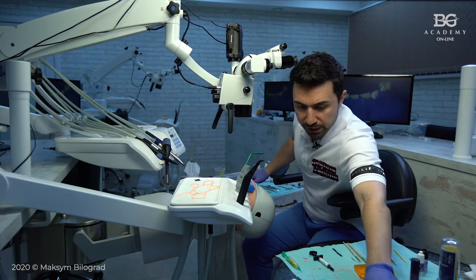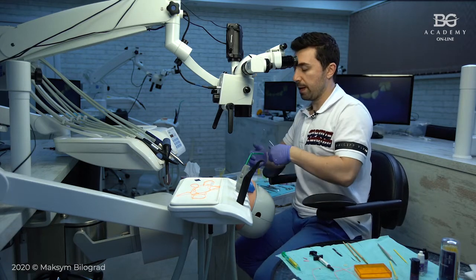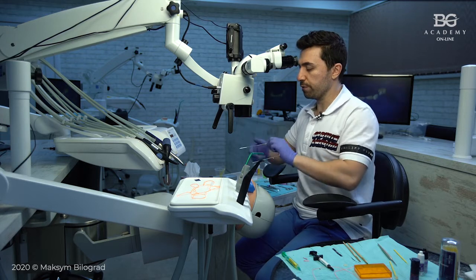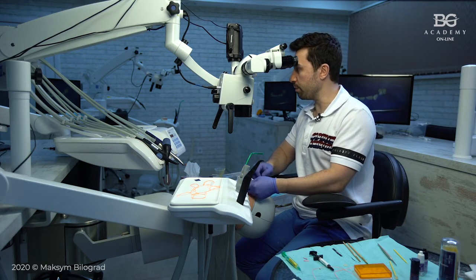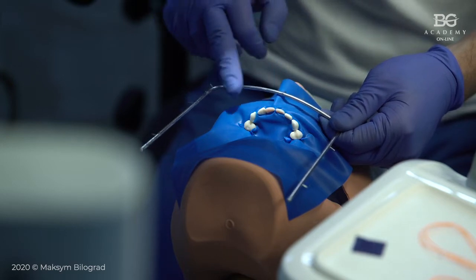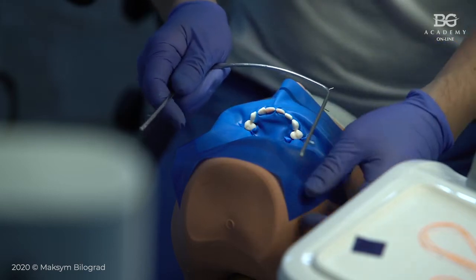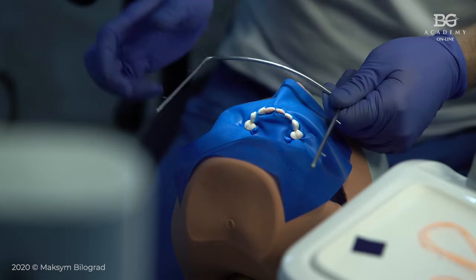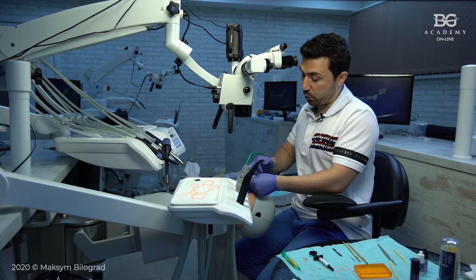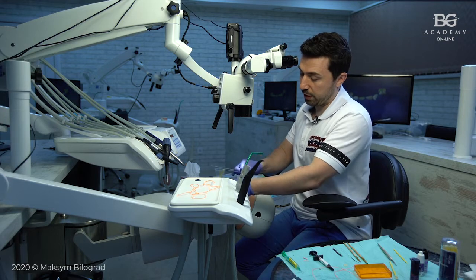When we do cementation of veneers or crowns or whatever on the upper jaw, personally I prefer to use the frame in a non-classic way. So basically we use this frame when the bar is up. Many of you know why we do this. If you don't know this trick, I will show you later on why we use the bar opposite. You will see it is really interesting and efficient.